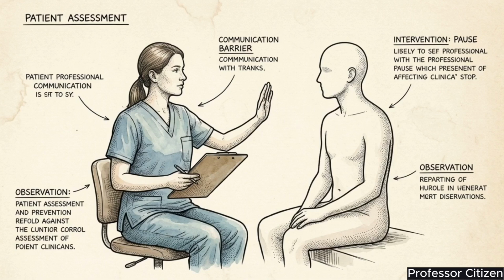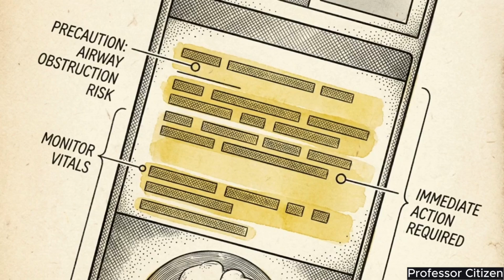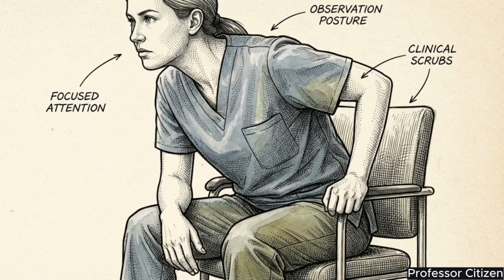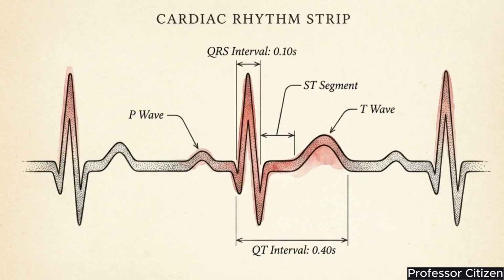You must rigorously screen the patient for contraindications. The test requires the patient to generate extreme intrathoracic pressure. Because of this force, conditions like recent abdominal surgery, pneumothorax, or unexplained hemoptysis mean the patient is strictly prohibited from testing. Even in cleared patients, the physical exertion of the test carries risks. You need to monitor them closely for syncope, dizziness, paroxysmal coughing, or bronchospasm. Bypassing this safety screen converts a routine diagnostic procedure into a potential trigger for a severe cardiopulmonary event.